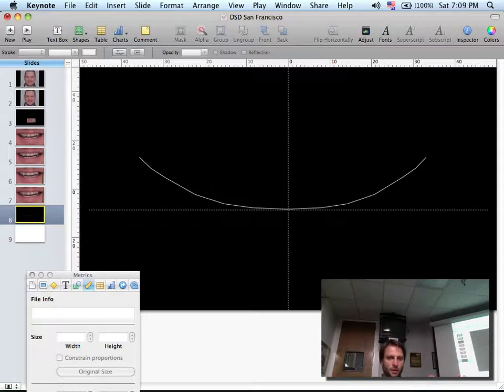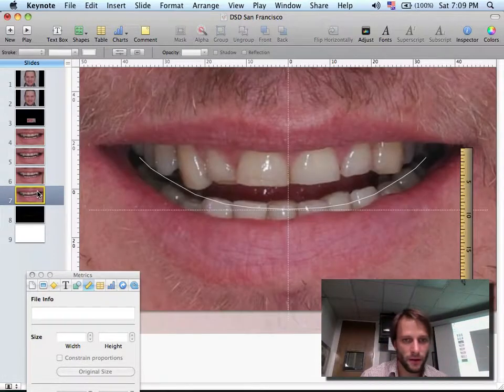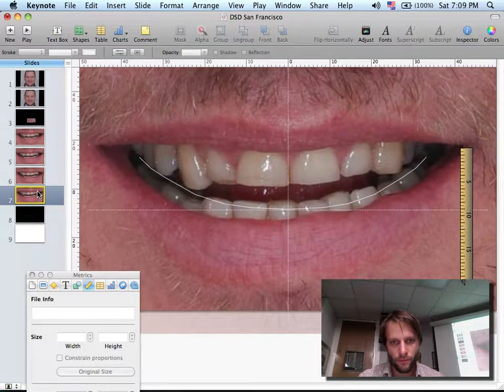and the feeling I have is that the right molar is stretching out here. You can see that this is kind of outside compared to that one. But this is kind of the limitation we're going to have in his case, because his arch is not symmetric. How did you get rid of the picture just to see the arch? Just click on the picture and delete. Then I go back to the previous slide and continue.